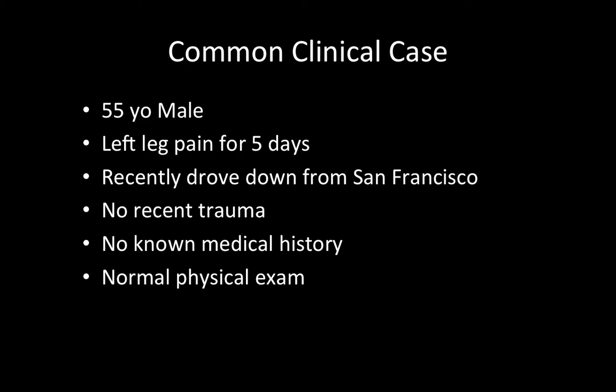This is a patient you could see in urgent care, primary care, but most likely in the emergency department. It's a 55-year-old male, left lower leg pain for 5 days. He has some concerning findings on history, most notably that he just drove back from San Francisco. Denies any recent trauma. He has no known past medical history.